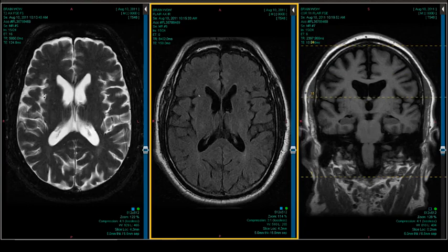Well, that's right. But it's a statement we often make, meaning you'll see a lot of reports saying diffuse cerebral atrophy. So what I try to do at least is whenever I say atrophy, I try to give a pattern of atrophy. Meaning not just say it's kind of diffuse, but parietotemporal, frontoparietal, because these are going to fit in with different diseases. The reason this scan is being done is they want a prognosis and they want to see if this is something that's treatable. So if we can give them the information that they need to pursue one or another track, they might be able to either tell the family more or, as we're going to see in some of the later cases, really find something treatable. So let's look at the pattern of the atrophy.